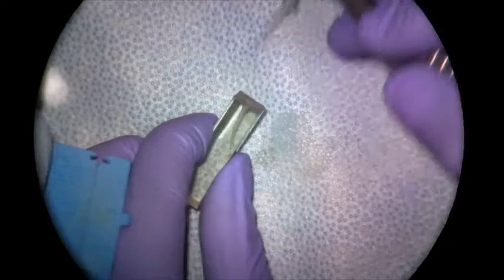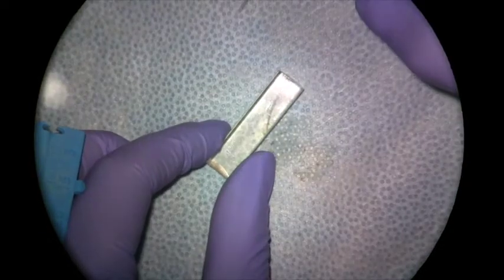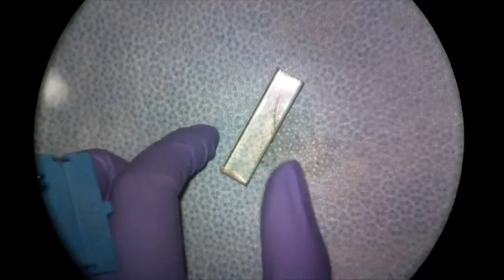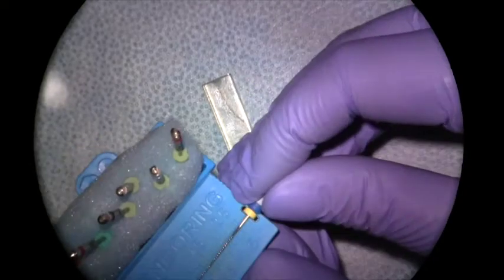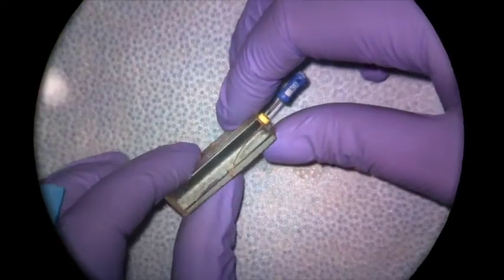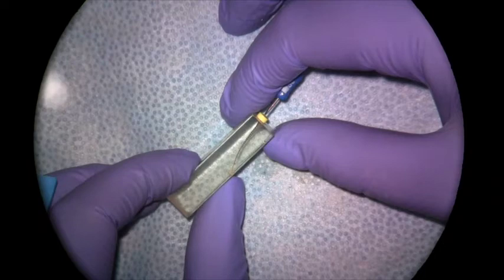From here we can continue to apically enlarge depending on the canal size. If we wanted our MAF to be 40, now that the 30 is going to length we would go to the 35, make sure that goes to length, and then move to the 40. If we're happy with our preparation to a 30.04 to length, 30 would be our MAF at this point. We would confirm that with an MAF file shot by taking a #30 hand file, measuring it to our corrected working length of 17, placing it in the canal to confirm a good seat, and taking a radiographic image to confirm it's at our length. If that's good, you'd be ready to carry on with obturation.